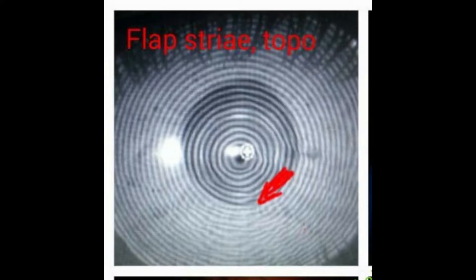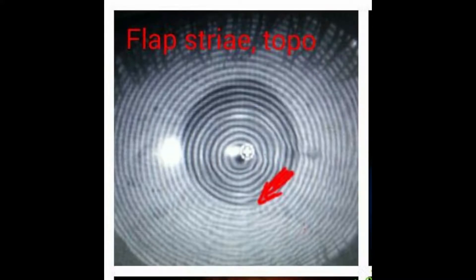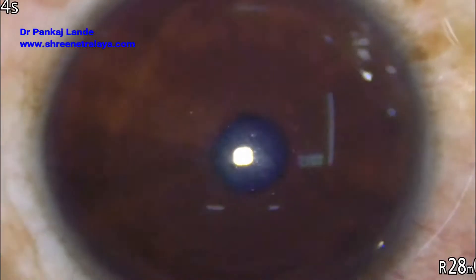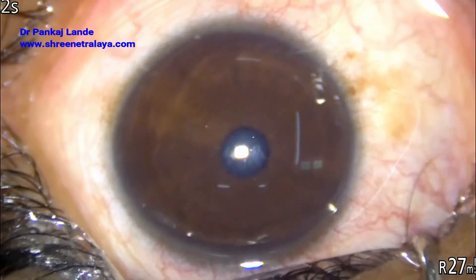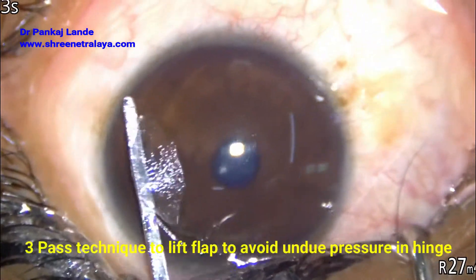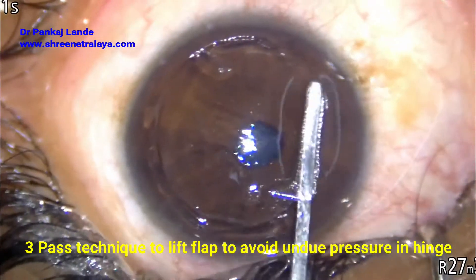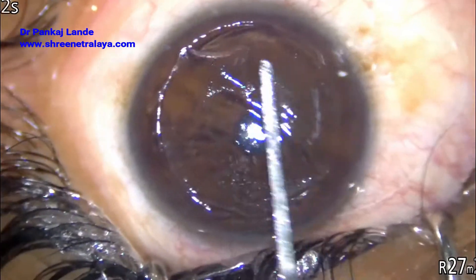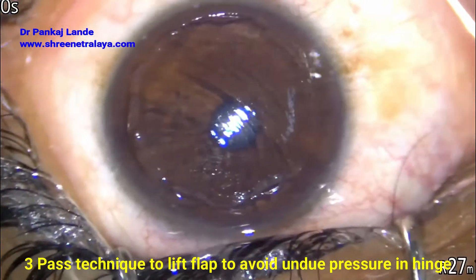We took the patient inside OT and lifted the flap. As you can see, the epithelium is fully healed. The flap is raised with a three-pass technique to avoid undue pressure on the hinge. Notice the microstriae on the flap.